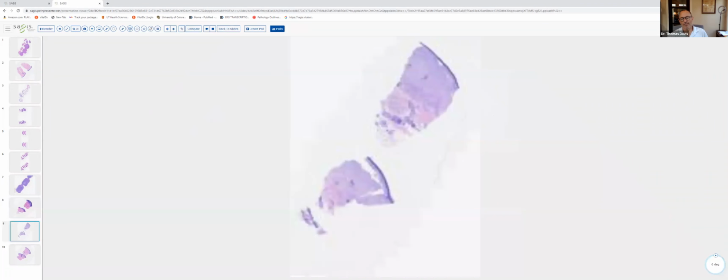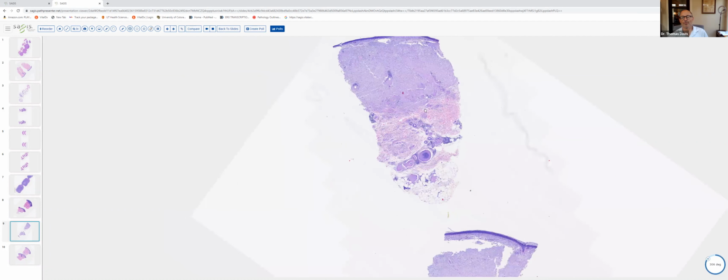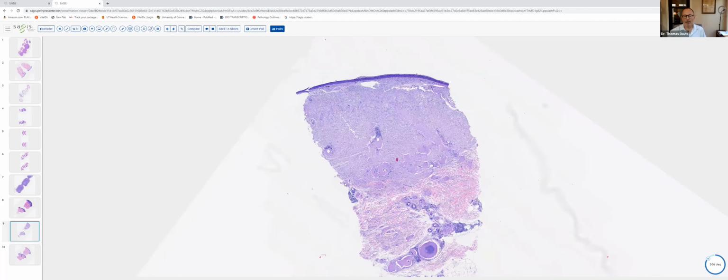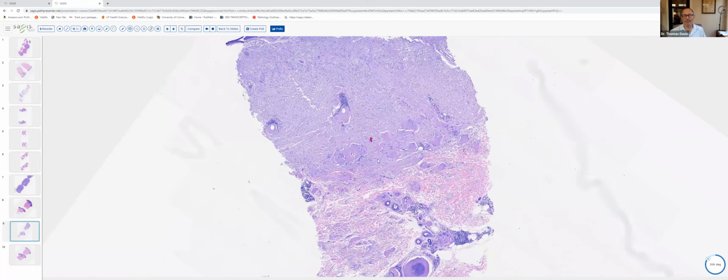Case number 9, the correct diagnosis, was in the deposition differential: nodular amyloid. In this punch biopsy specimen from the arm near the shoulder, one can see that the epidermis is thinned with effacement of the rete ridge pattern. Within the papillary and upper reticular dermis, there is deposition of material. You can see a striking contrast between the normal collagen and this material deposited in the dermis.